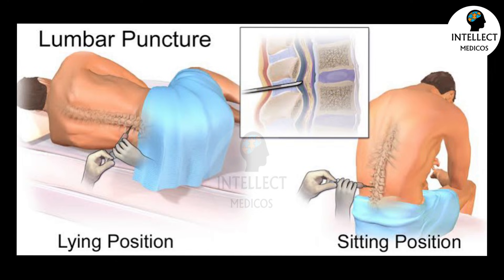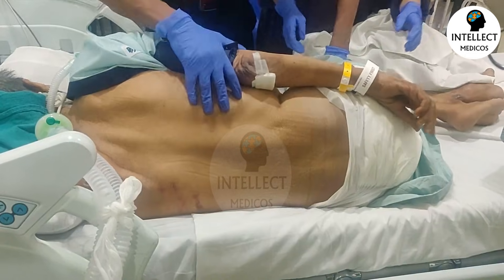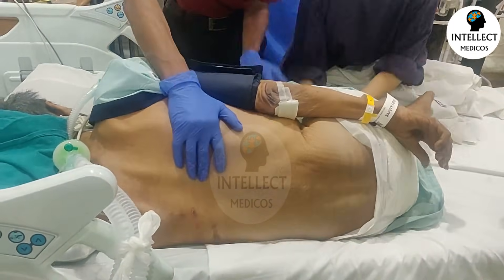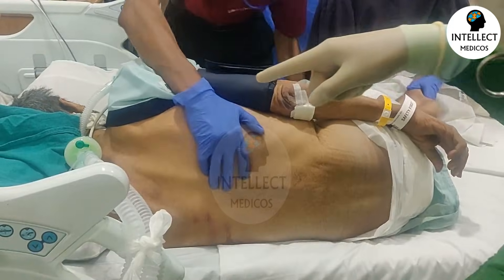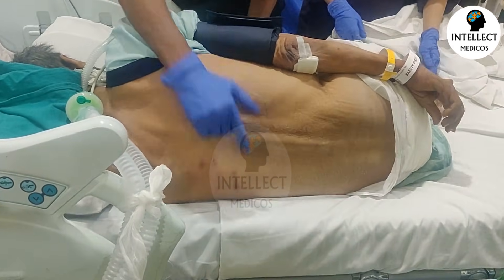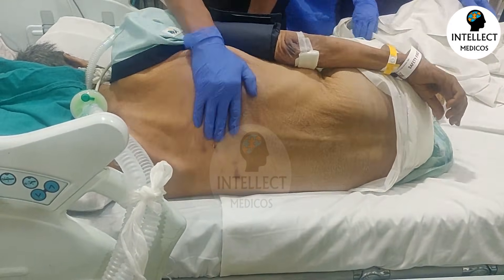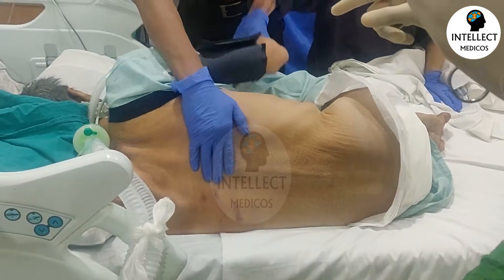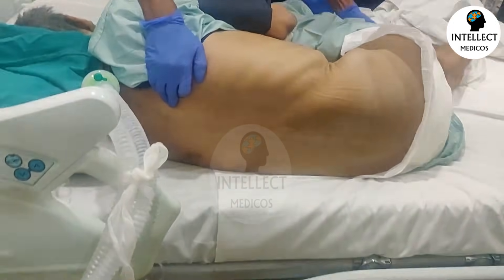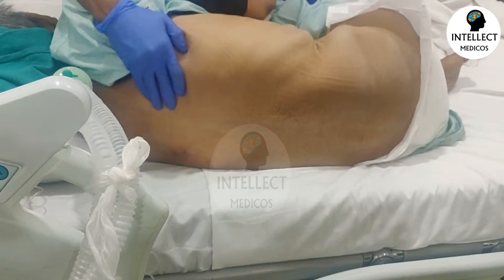The next step is patient positioning, which can be done in lateral position or sitting position depending on the clinical status of the patient. Bend the knees of the patient towards the tummy and straighten the back. Correct positioning is very important for you to enter into the subarachnoid space; otherwise you might end up doing the procedure again and again.